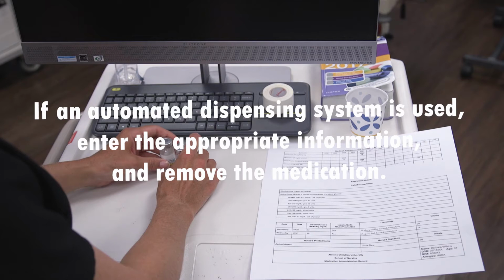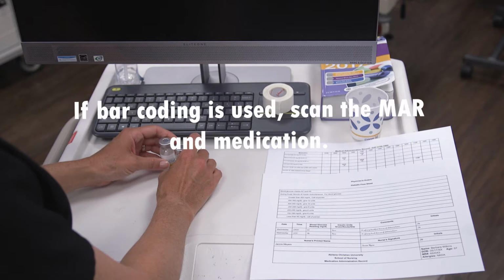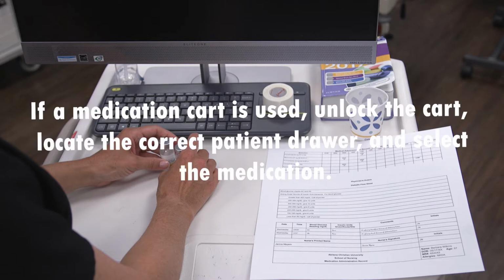If an automated dispensing system is used, enter the appropriate information and remove the medication. If barcoding is used, scan the MAR and medication. If a medication cart is used, unlock the cart, locate the correct patient drawer, and select the medication.